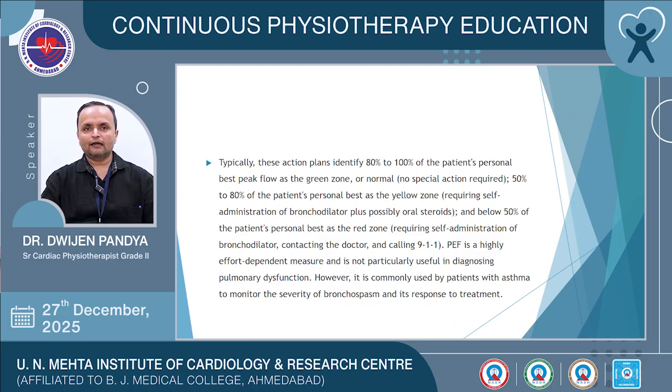Hence, peak expiratory flow is a highly effort-dependent measure and is not particularly useful in diagnosing pulmonary dysfunction, but it is commonly used by patients with asthma to monitor the severity of bronchospasm and its response to treatment.